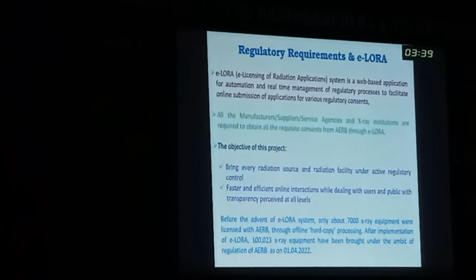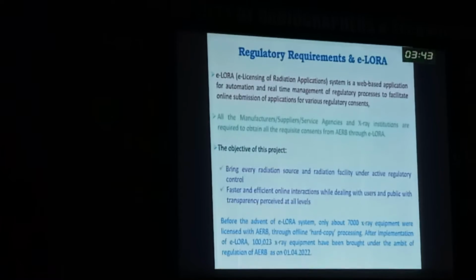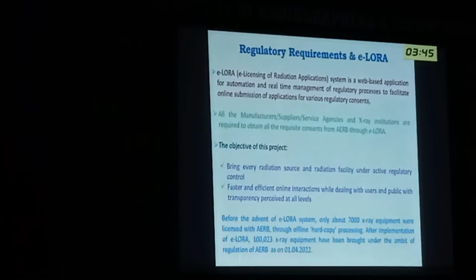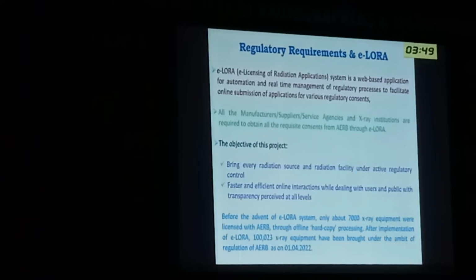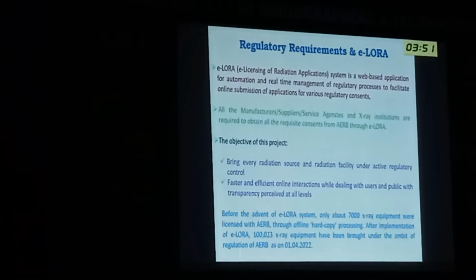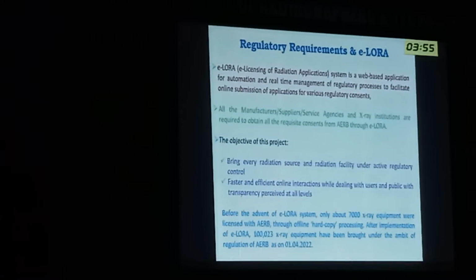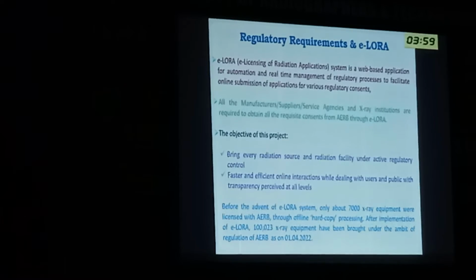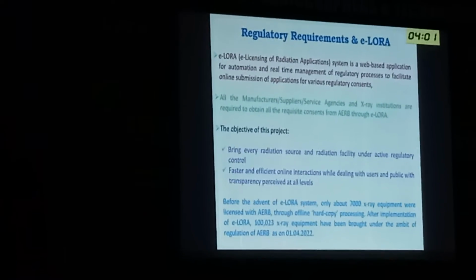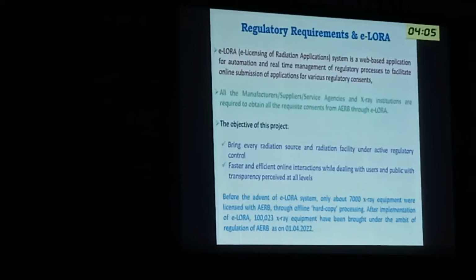Before implementation of eLORA, there were hardly 7,000 X-ray machines registered with AERB through the hard copy system. Right now we have achieved up to 1 lakh machines. Users are also getting a lot of benefits. They can track the status of their applications. If any problem is there, they can put a query and it can be sorted out immediately.